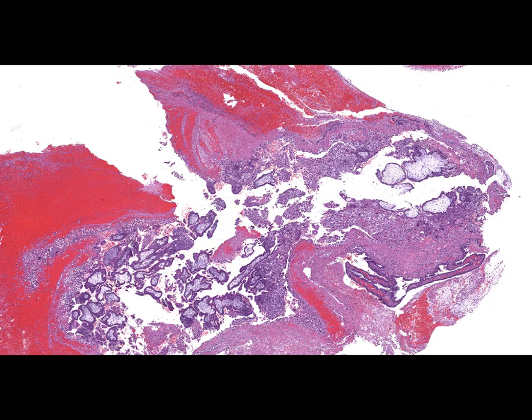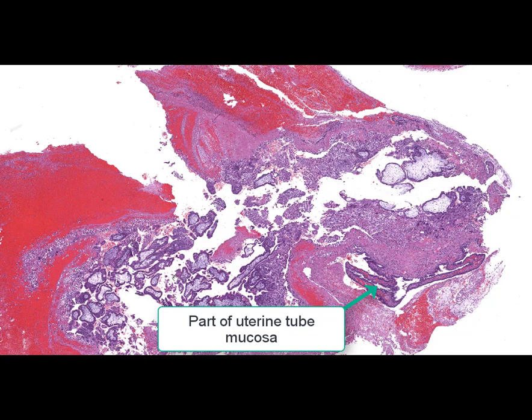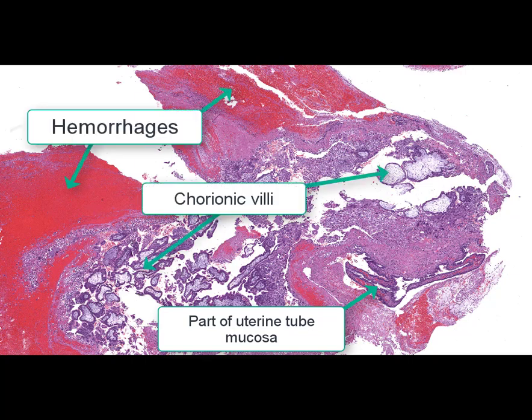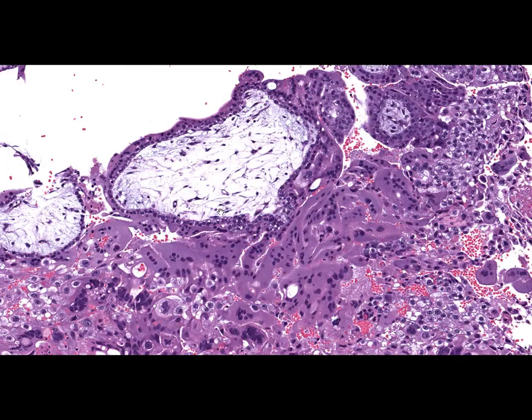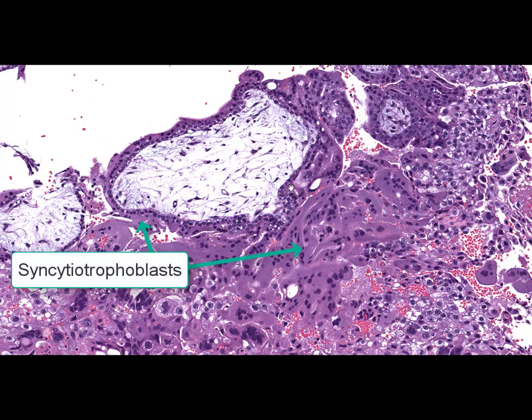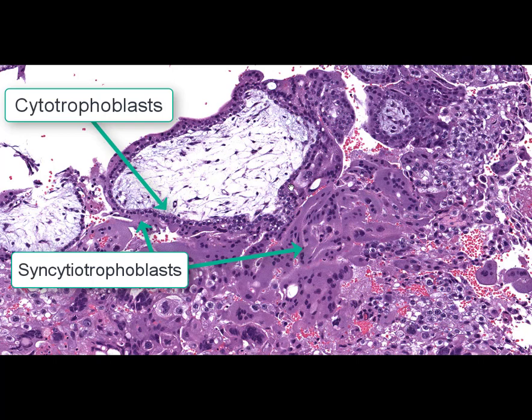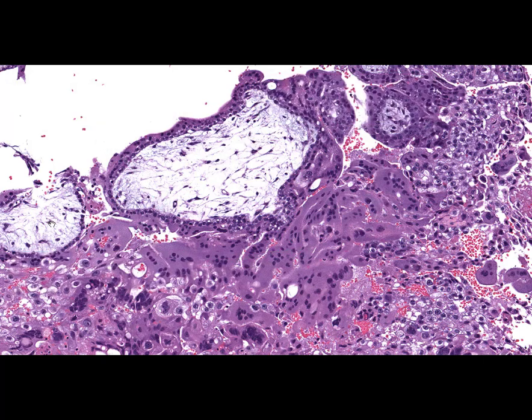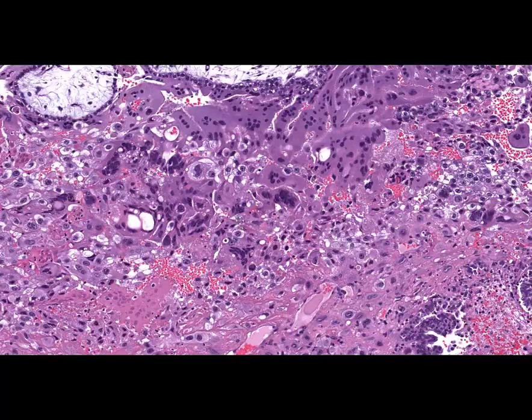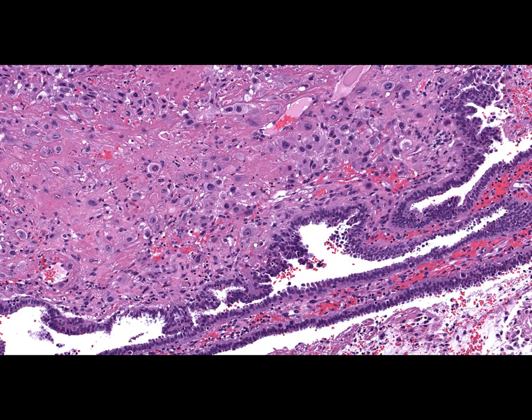On this slide we can see a discontinued pregnancy. At low magnification, we can see small areas of mucous membrane of the uterine tube, numerous chorionic villi, and a large hemorrhagic area. At high magnification, the chorionic villi are presented by trophoblasts — syncytiotrophoblasts and cytotrophoblasts — as well as the stroma of the chorionic villi. Changes related to the decidualization process are found in mucous and submucous layers of the fallopian tube, manifested by the presence of large cells with large nuclei.